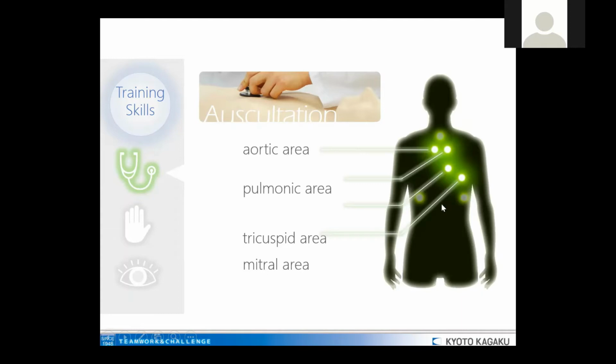And this has also a very important reason. Unlike other simulators in the market, this model doesn't work with sensors. There are no sensors in this simulator, only speakers.